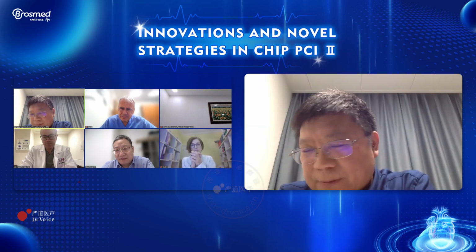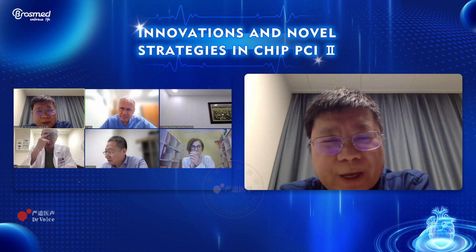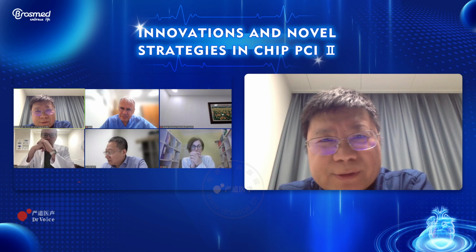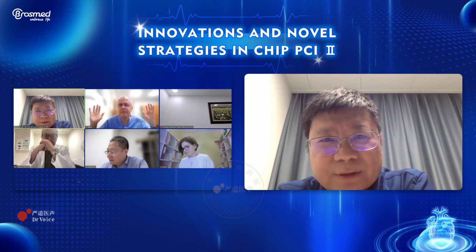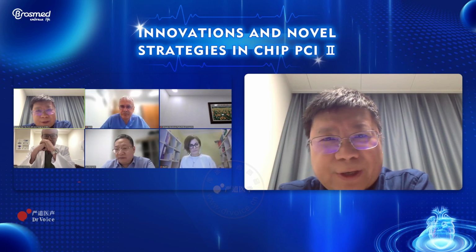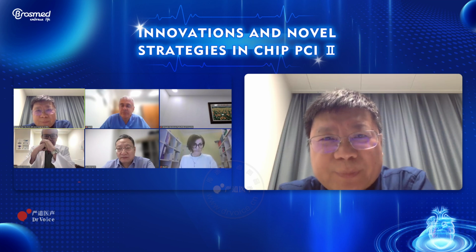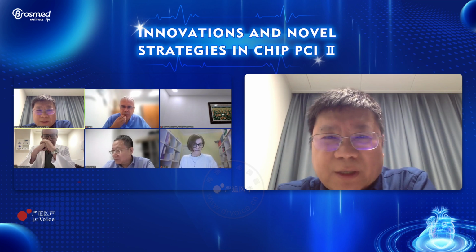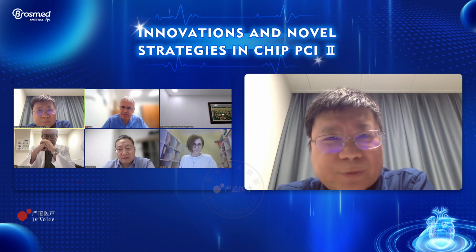But for the drug-coated balloon with sirolimus, maybe we need more clinical trials. As mentioned by Professor Galli, it is a special balloon, encapsulated in the polymatrix sometimes, and it just depends on the clinical trials. We just need to see.